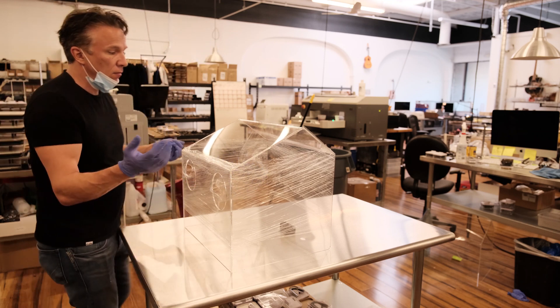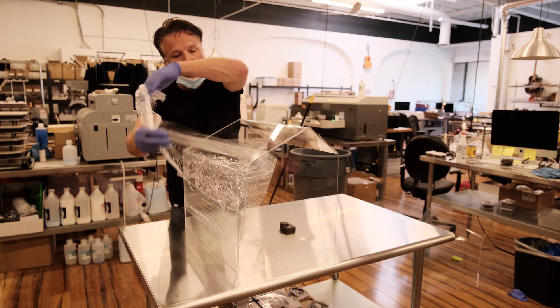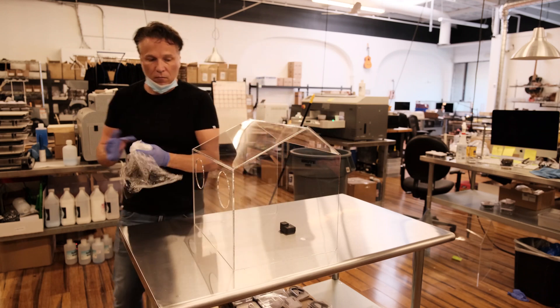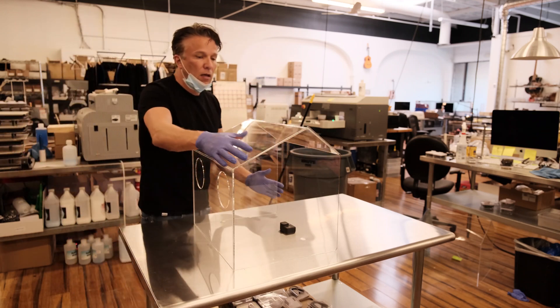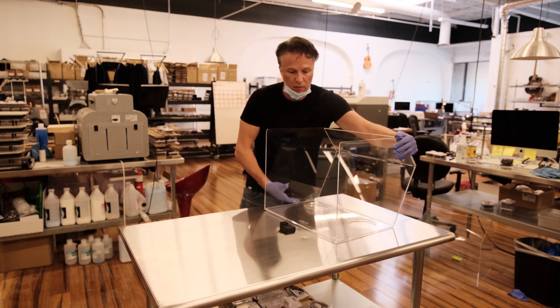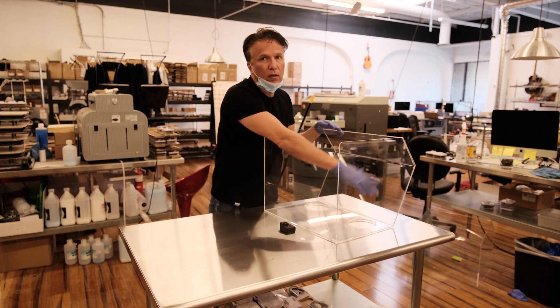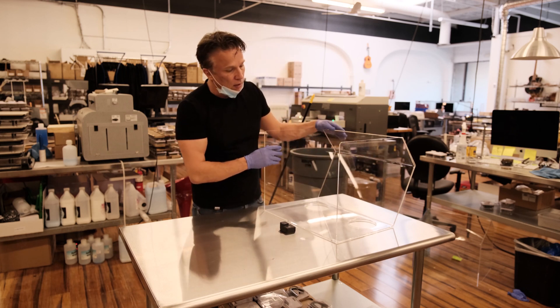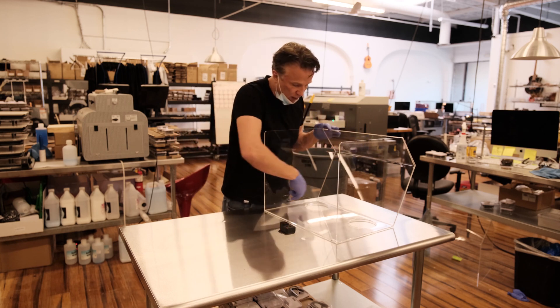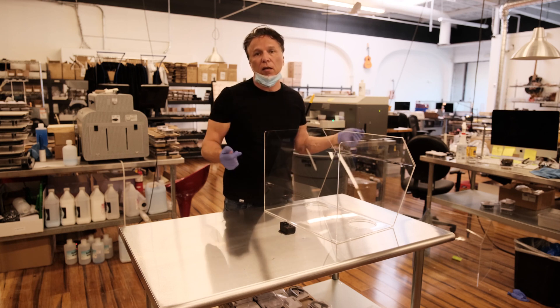Once you're done, you can basically just remove the cling wrap. Then flip the box upside down and use sterile wipes or alcohol wipes to clean out all of the crevices. We've made this box the same way you would make an acrylic aquarium, so it has watertight seals around all the edges — you should be able to get your wipes in and around there.